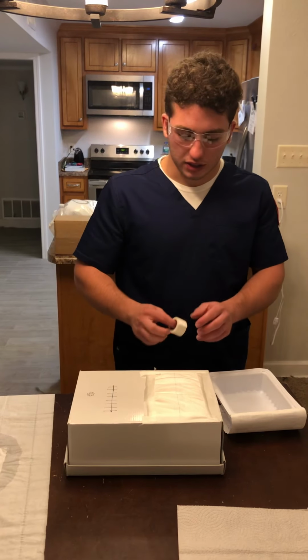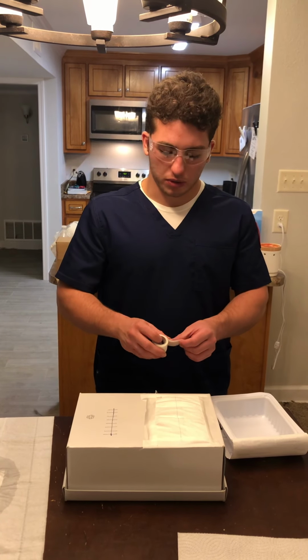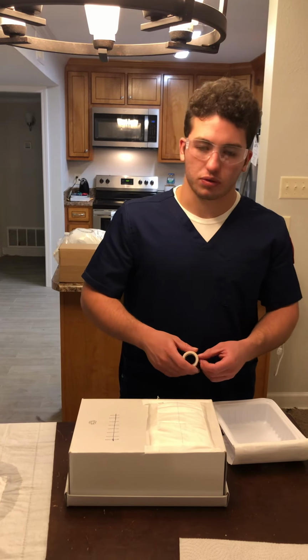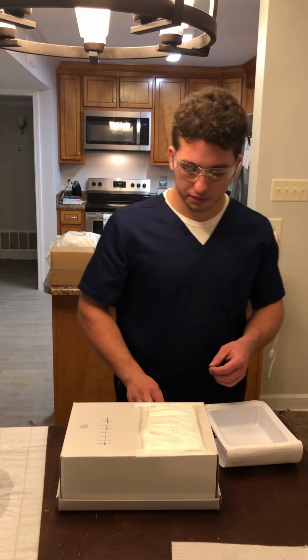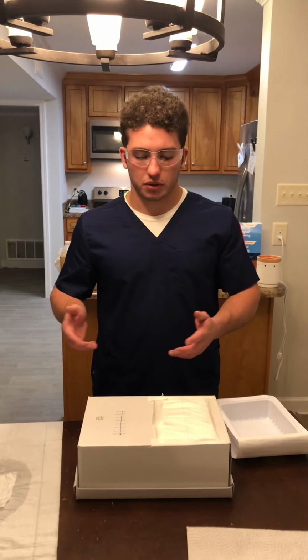Now that I have all sides of the abdominal dressing taped down, I'm now going to place another piece of tape on the abdominal dressing with the date, time, and my initials, and that's for the next nurse to know when the dressing was changed and who changed it. Okay, now that that's done, I am going to lower the patient back down to a safe height and make sure that they are in a comfortable position.